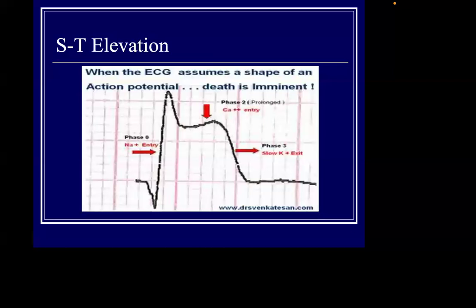So you should keep doing ECG, and we will discuss this in the presentation of acute coronary syndrome, inshallah. So in minutes, there is the hyperacute T wave. Then in hours, there is ST segment elevation, and usually after 12 hours, you will find a Q wave in the ECG. But in the era of CMR, or cardiac MRI, people found that sometimes the Q wave will come early, before 12 hours.